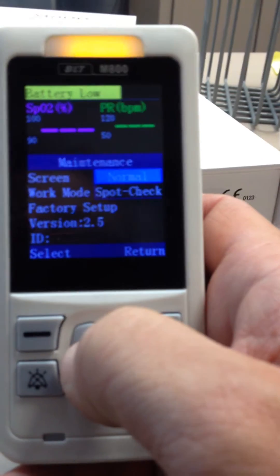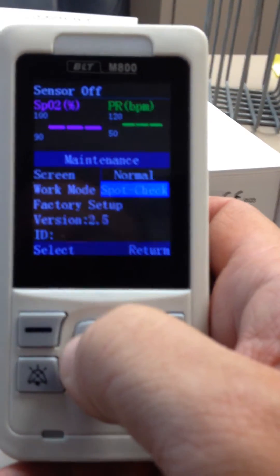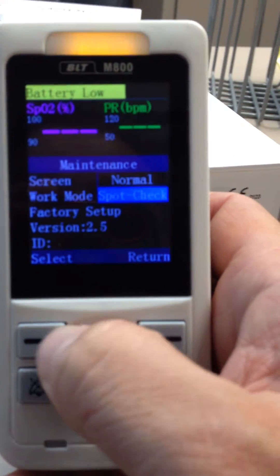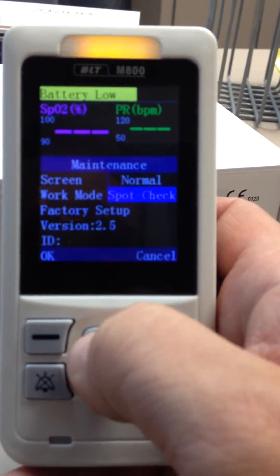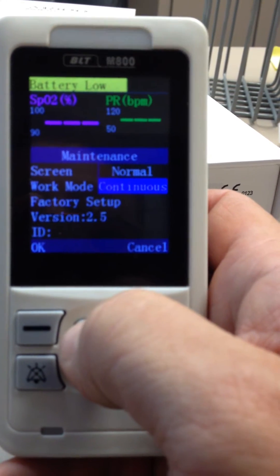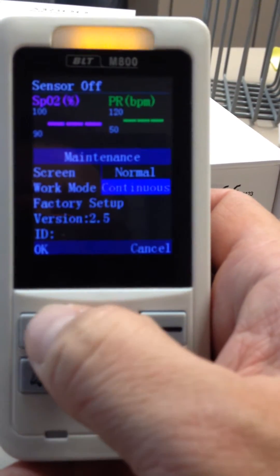The second option is Work Mode. It's currently set to Spot Check. Press Select and change it to Continuous.